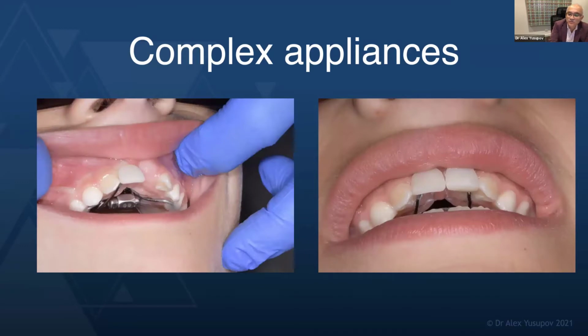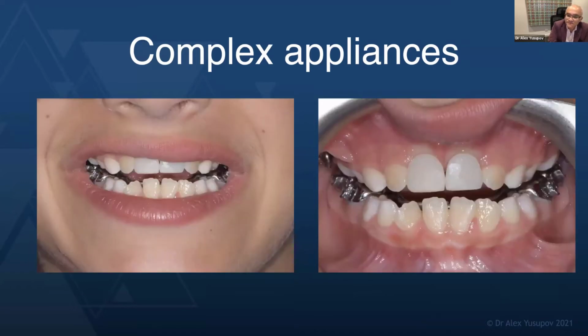And his ability to cope and now smile without having a flipper while we're opening up spaces and working away is incredible. And once again, this just was not possible without 3D printing. It's just something we could not do as little as 3 or 4 years ago.